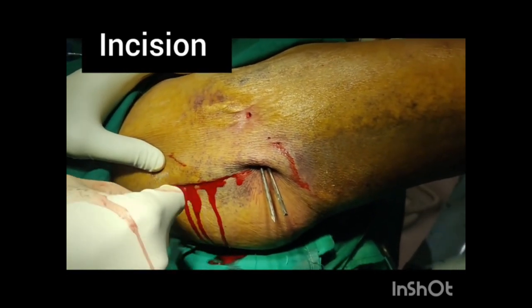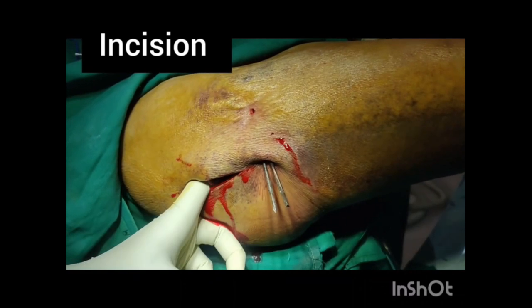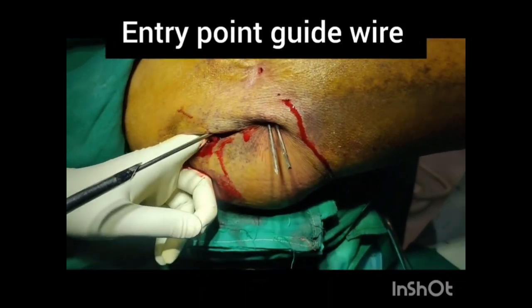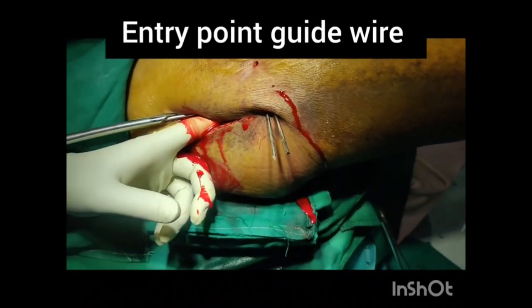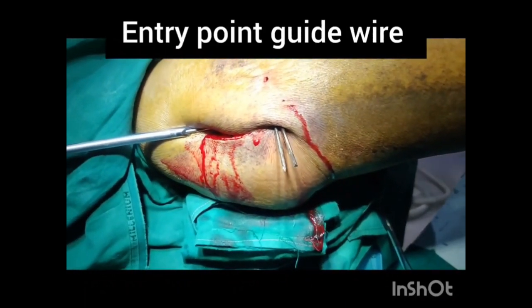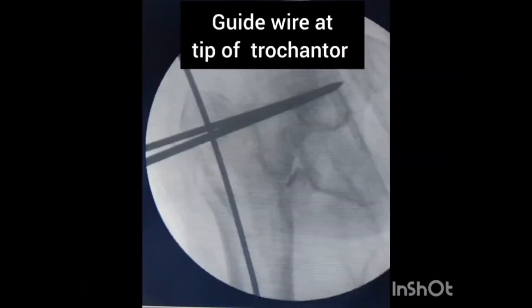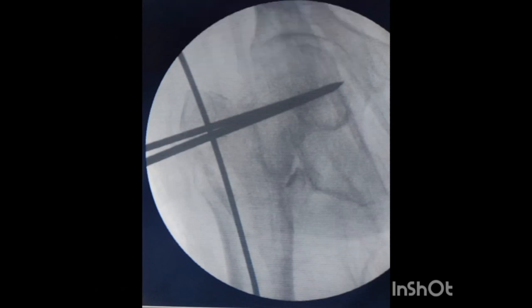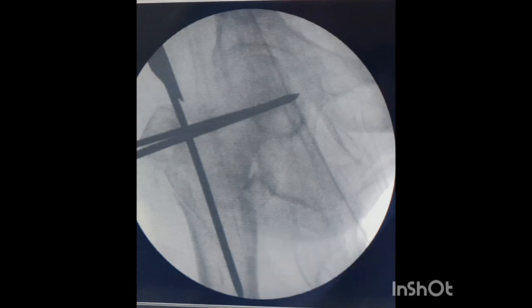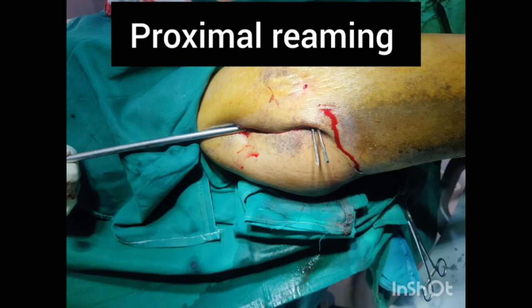A five centimeter incision is given superior to the greater trochanter. With a finger, palpate the tip of the trochanter, then pass the entry guide wire and check in the C-arm. It should be in the center and medial to the tip of the trochanter. Here the guide wire was slightly laterally placed, which is not desirable, so I changed the entry point. Now it is medial to the trochanter tip, precisely in the piriform fossa.